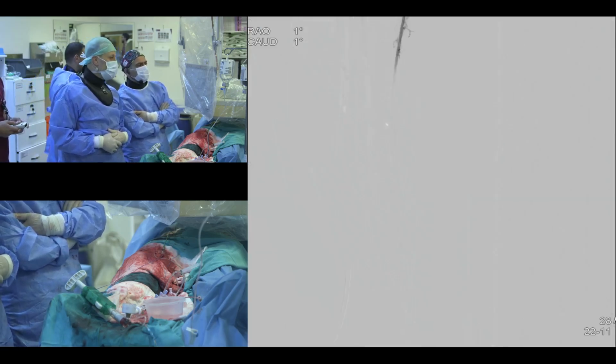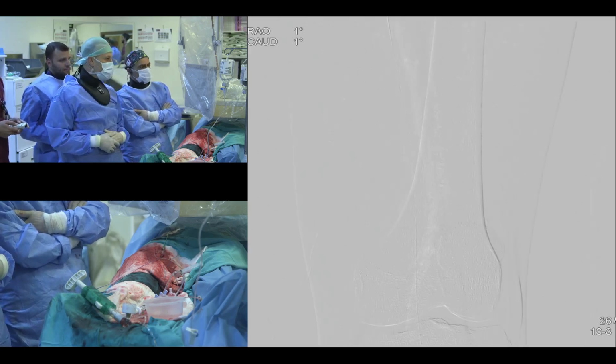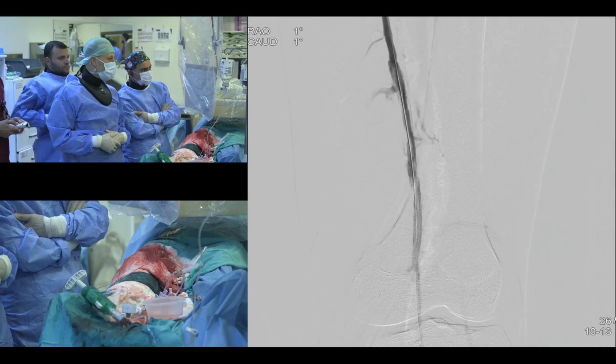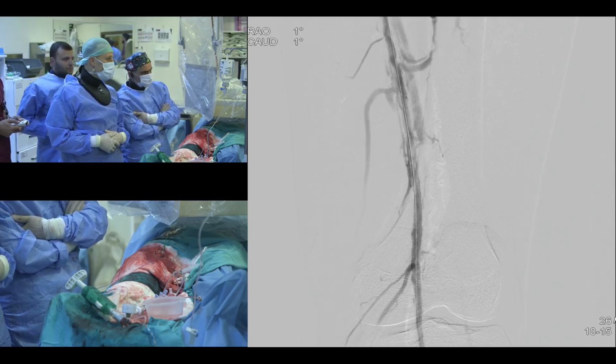Now, what do you think is going on with this pipe? Because at this time, I'm scratching my head. What is going on? And this is where I will tell you, I goofed up. I didn't do a test, which I would teach you guys to do, and I will start doing it regularly, to rule out popliteal artery compression.